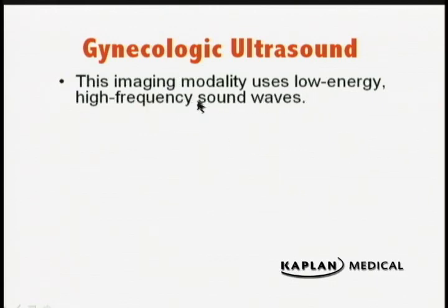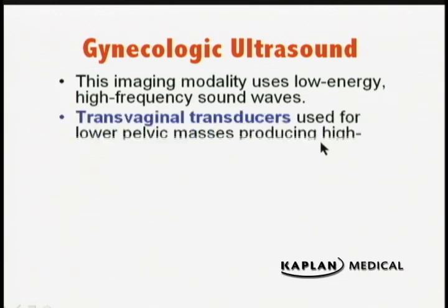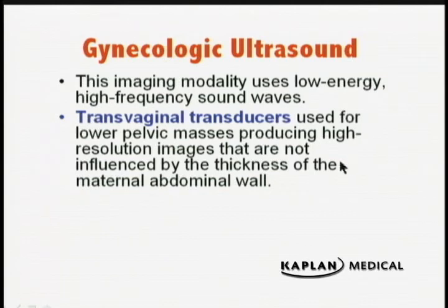This imaging modality uses low-energy, high-frequency sound waves. Sometimes it is called sono, sometimes it is called sonography, but it is basically the same. It works in the same fashion as radar. Transvaginal transducers can be used, or transabdominal transducers. The transvaginal transducers have advantages in that they produce high-resolution images irrespective of the abdominal wall thickness of the mother.